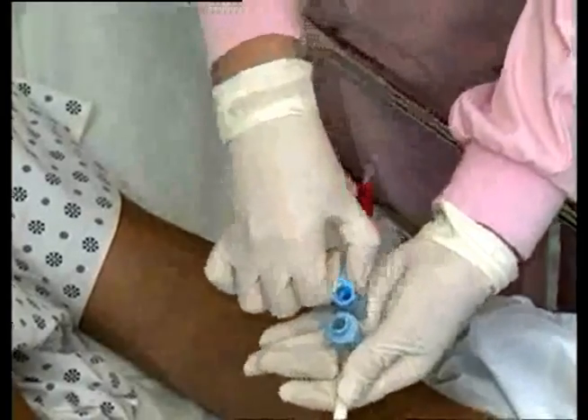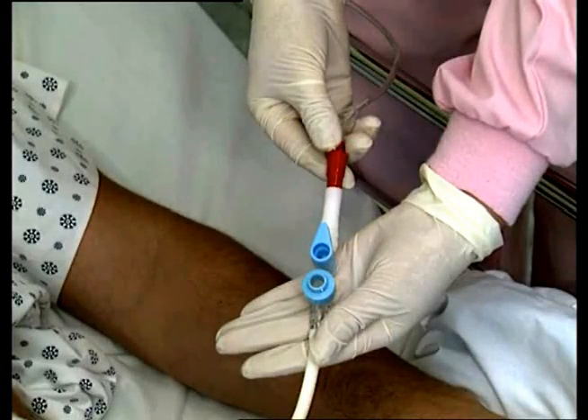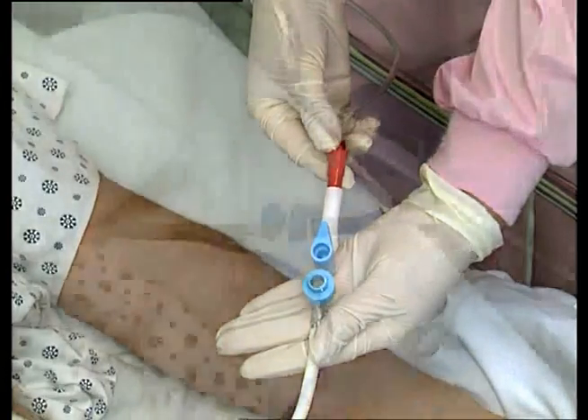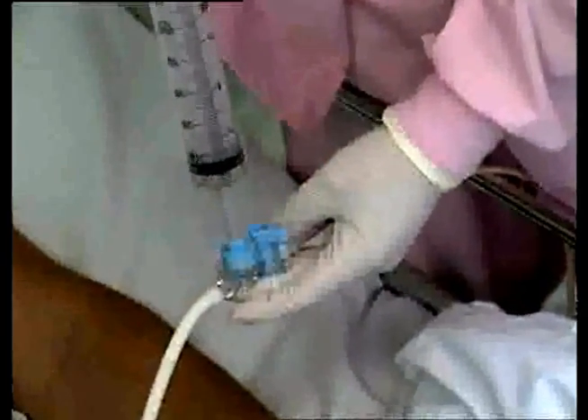The ACE Connector has an on-off handle with built-in stop positions, which make the connector simple to operate and which minimizes operator error. Use the on position to feed and suction patients. Use the off position to irrigate and medicate patients.